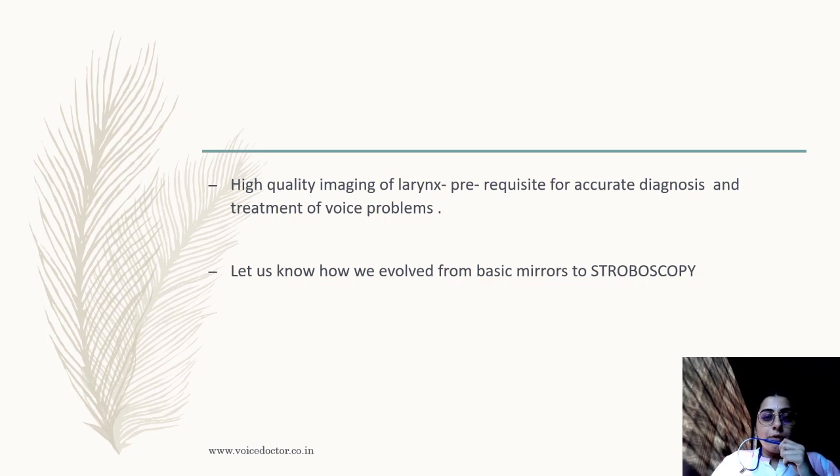Now we have understood that to visualize the larynx or the voice box, we require high quality imaging, and this is a prerequisite to come to an accurate diagnosis and to treat a patient with a voice, swallowing, or breathing problem. Now, let us understand how we have evolved from the basic mirrors of the 18th century to stroboscopy, which we have today, the best technology to see voice problems.